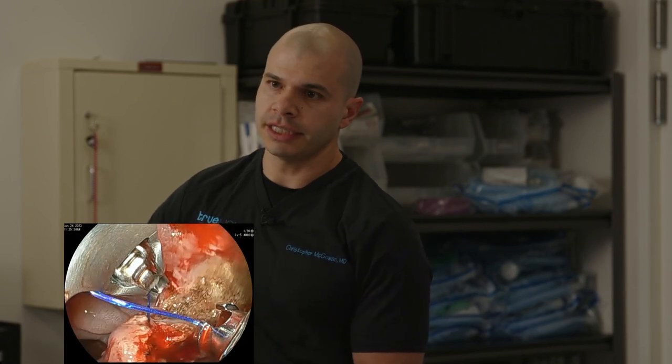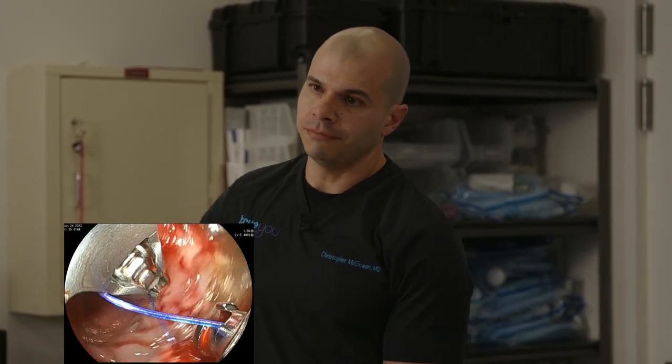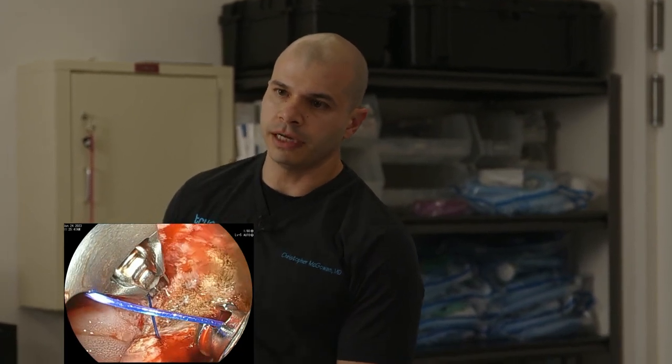So here, there's less of a ridge to grab with our suturing system. As you can see, it's kind of a flat area in the anastomosis. We do encounter this. This is a situation where I may use a helix, or I may just try to maneuver the scope here a bit to get more of an angle.